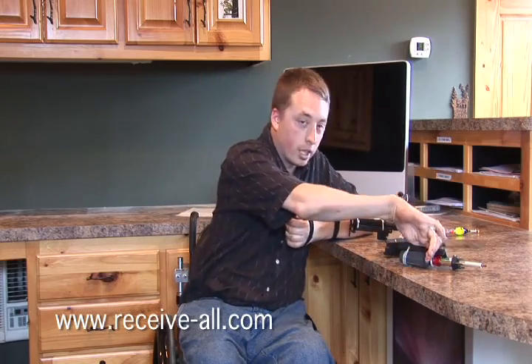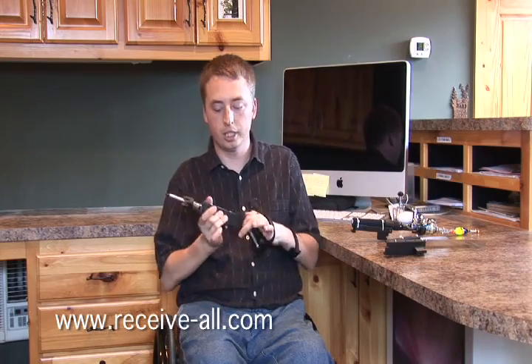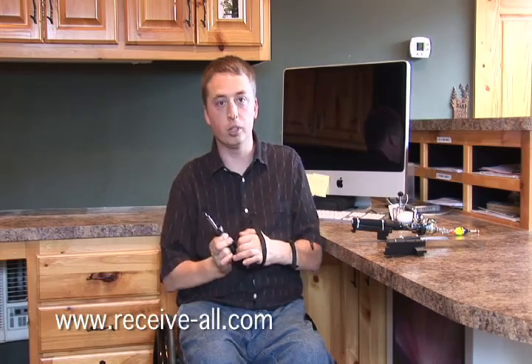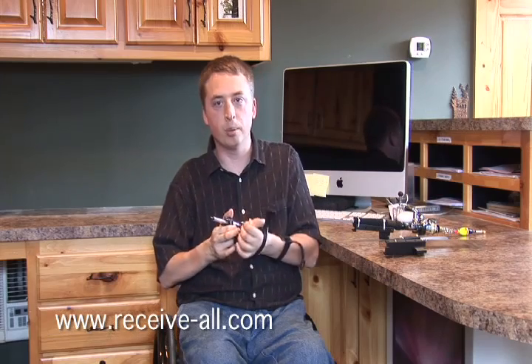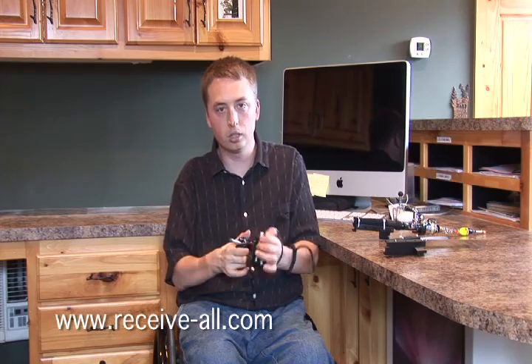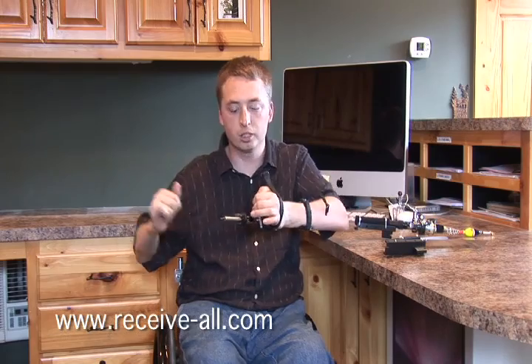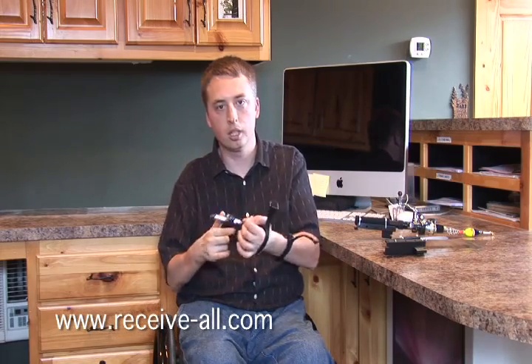And lastly, that I get a lot of use out of, is a screwdriver. In this case, it's a ratcheting screwdriver that allows me to turn the screws both ways. So here I have it attached, and now there's certain hobbies I have where I need to tighten and loosen the screws by myself. I can set the screwdriver to tighten, and now I have a solid platform I can use my other arm to brace myself when I'm tightening it, and same with going backwards. And it's just that simple.